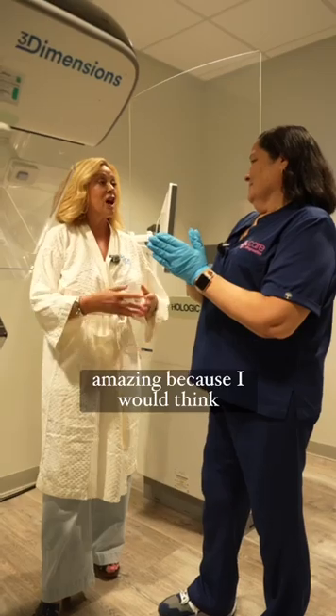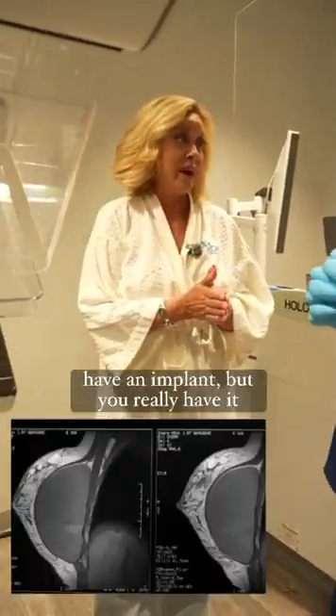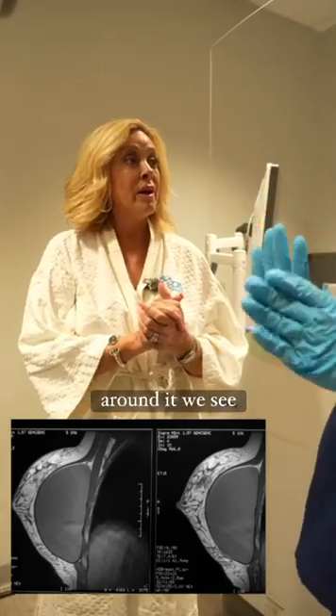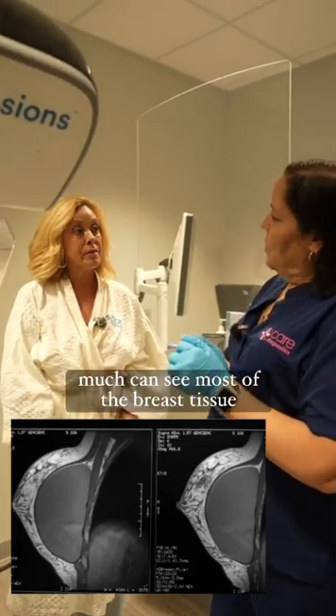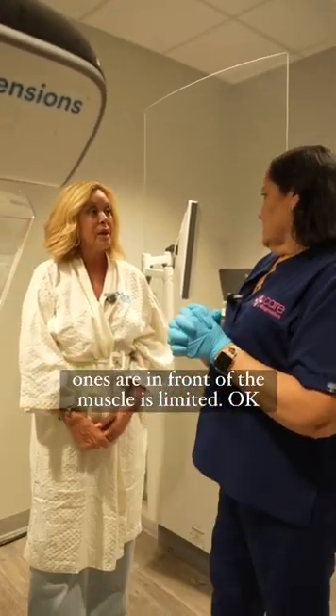That's amazing, because I would think it would be hard to see all areas when you have an implant. But you really have it down where you're getting the whole view. We can see around it. If they're behind the muscle, we pretty much can see most of the breast tissue. The ones that are in front of the muscle, it's more limited.